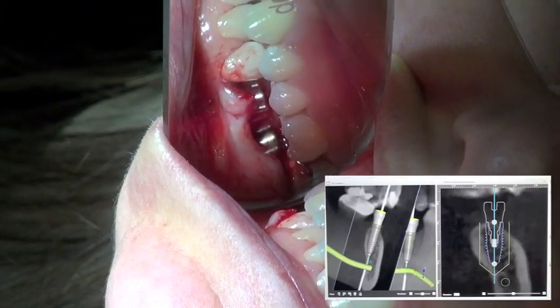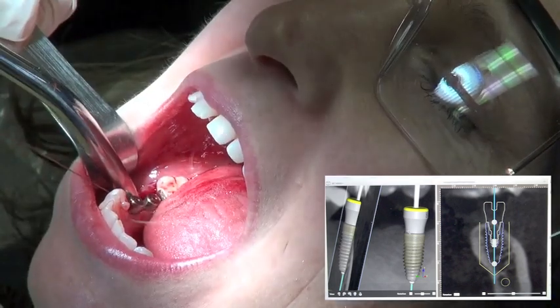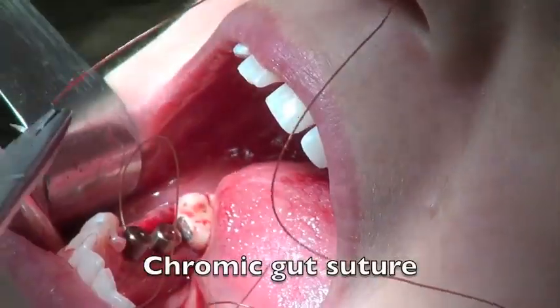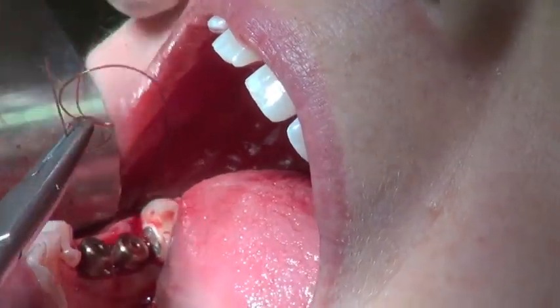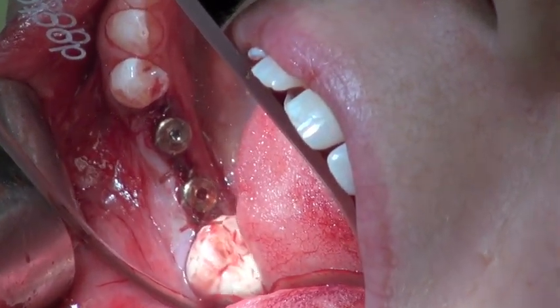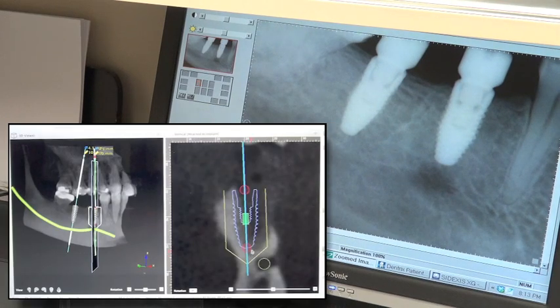Checking the space, it's very similar to what the concept was during planning — the implants are in a good spot with the prosthetic space needed to restore them, and they're in a screw retained position. I'm using a gut suture to close the area, and then we'll let these heal for about three months. You can see it's sutured around the top of the implants and the platform shift is going to allow proper healing.